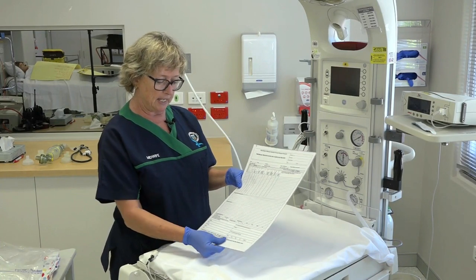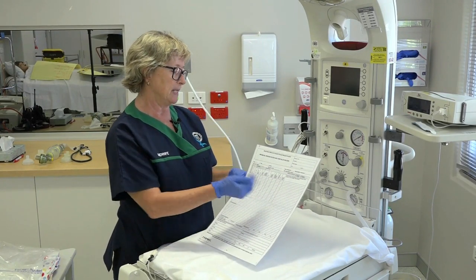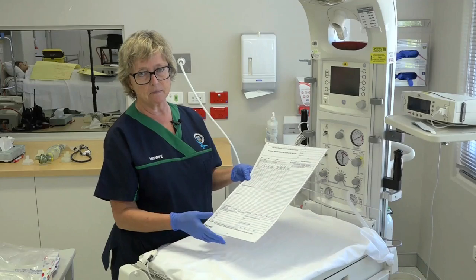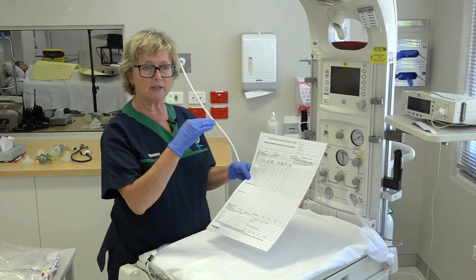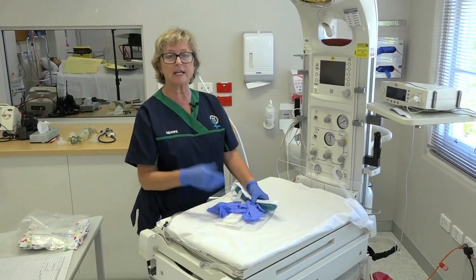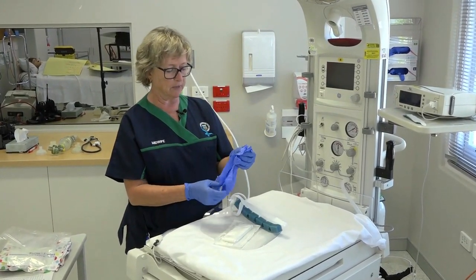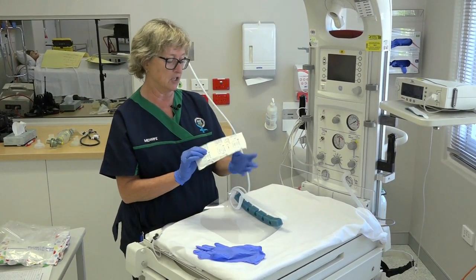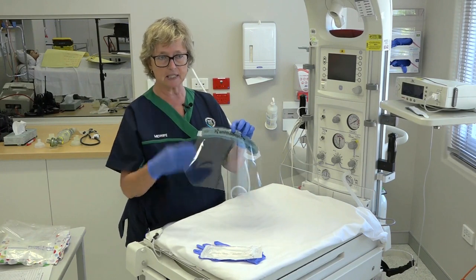We need to document the entire resuscitation process, and it's important that a complete timeline is recorded. Some places will have a code blue record that is started as soon as the code blue is called; others may use a patient progress sheet. It's important to have a date, a start time, and a time for every step in the resuscitation. We also need to protect ourselves from secretions and splashes using personal protective equipment: gloves after hand cleaning, a sterile plastic apron, and if splashes are anticipated, a face shield to protect the eyes.